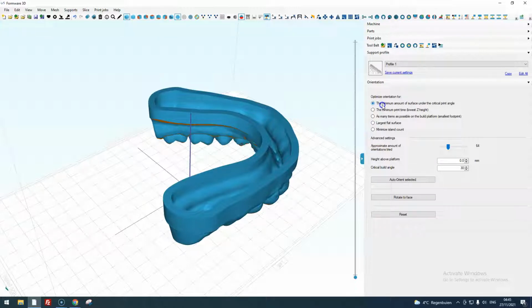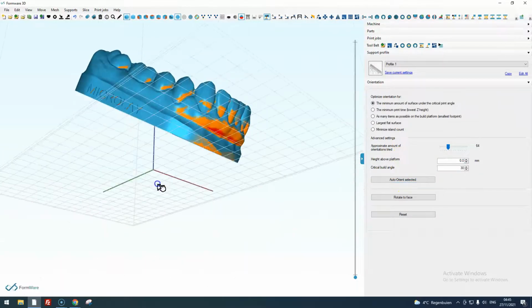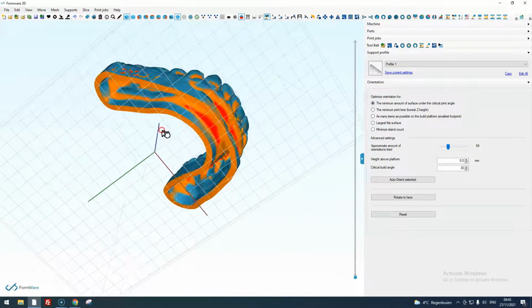The first one being the minimum amount of surface under the critical print angle. So the critical print angle is defined here. This is basically a machine specific parameter that's set up in the support profile. And this tells you how much overhang you can print without adding supports. So ideally, you would like to minimize the amount of surface under this angle. So if I select the first option like this, it will calculate a new rotation, and you will see that the amount of red critical surface is minimized.